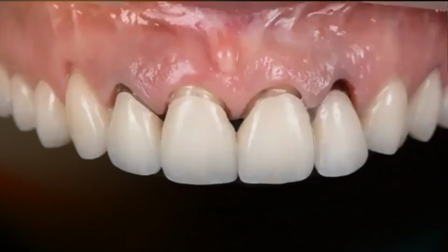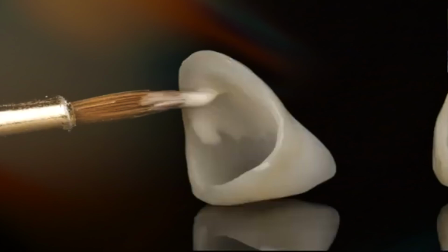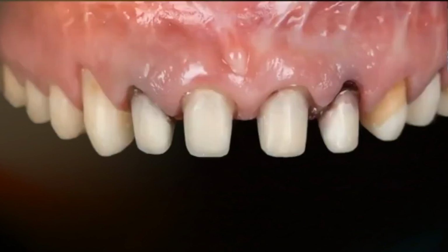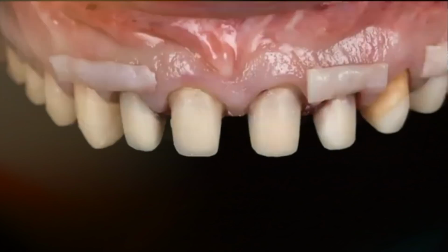And here in this area, we plan to stain inside. Here's a little bit more stain put just to show on the slide better, but you have to put a little bit just in that cervical area. And then you do the try-in, okay? When everything's okay, and this is the day you're going to bond, and this case I did with Gustavo and Marcelo Giordani. And we always do like this. At the day of the bonding, we do the try-in.